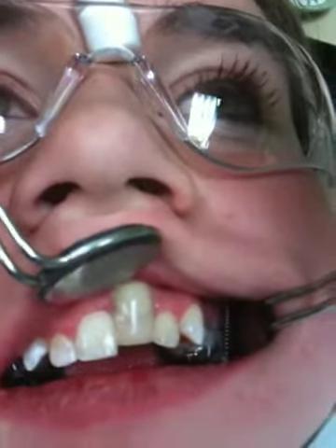Let me turn your head to the left. I'm going to subtract it a little more. Let's show the anterior. This side is up. To the next side.